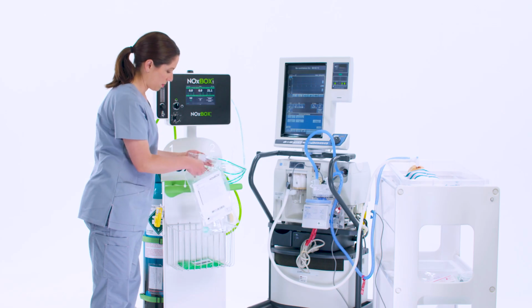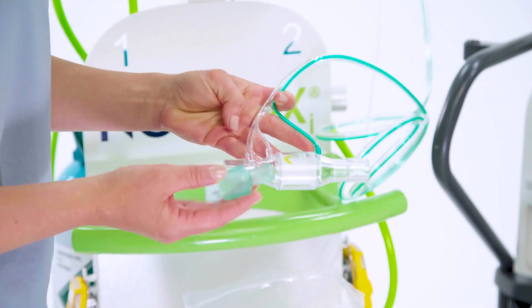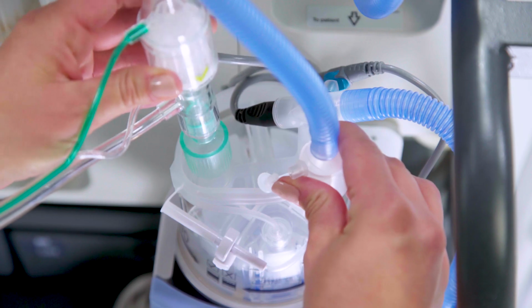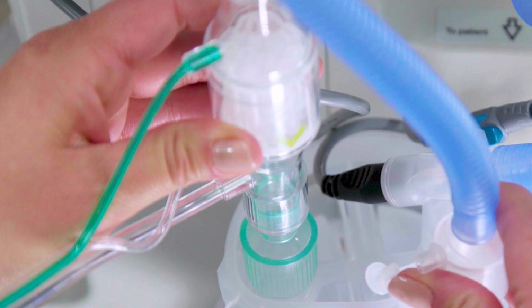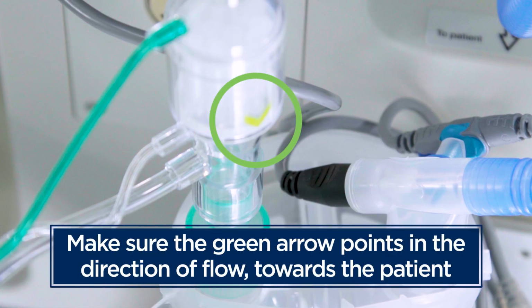This circuit contains a humidifier with 22 mm connections, so we'll need to use a connector from the NOx kit. Connect the 15 mm end of the NOx flow connector to the NOx flow sensor with the green arrow pointing towards the connector. Quickly disconnect the tubing that connects the ventilator inspiratory limb to the dry side of the humidifier and place the NOx flow on the humidifier with the green arrow pointing into it. Quickly place the tubing from the ventilator onto the open end of the NOx flow. Make sure the green arrow points in the direction of flow towards the patient.